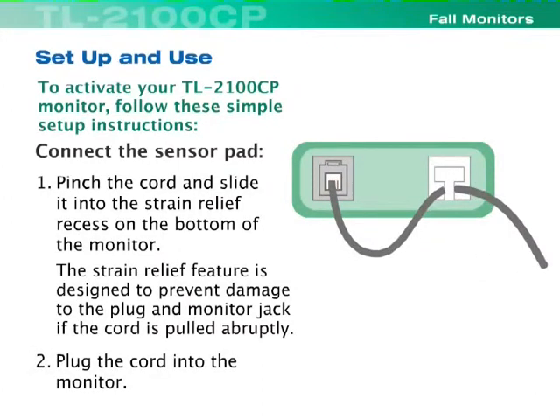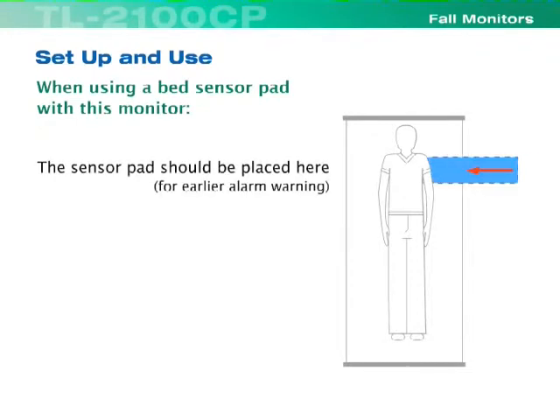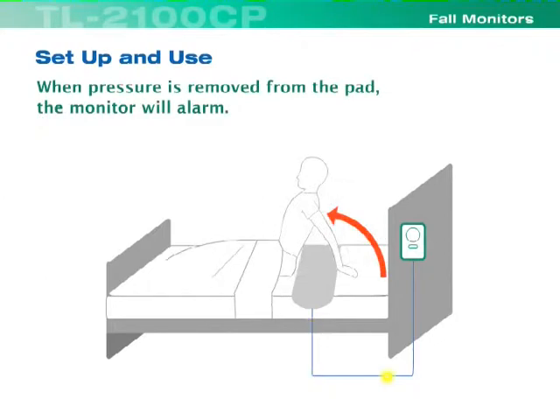Plug the cord into the monitor. When using a bed sensor pad with this monitor, the sensor pad should be placed here for earlier alarm warning, or here. When pressure is removed from the pad, the monitor will alarm.